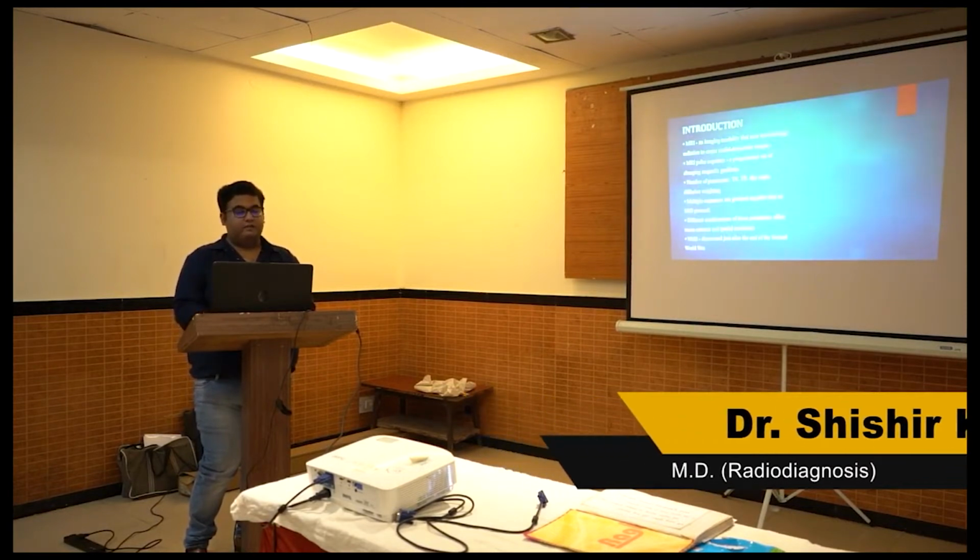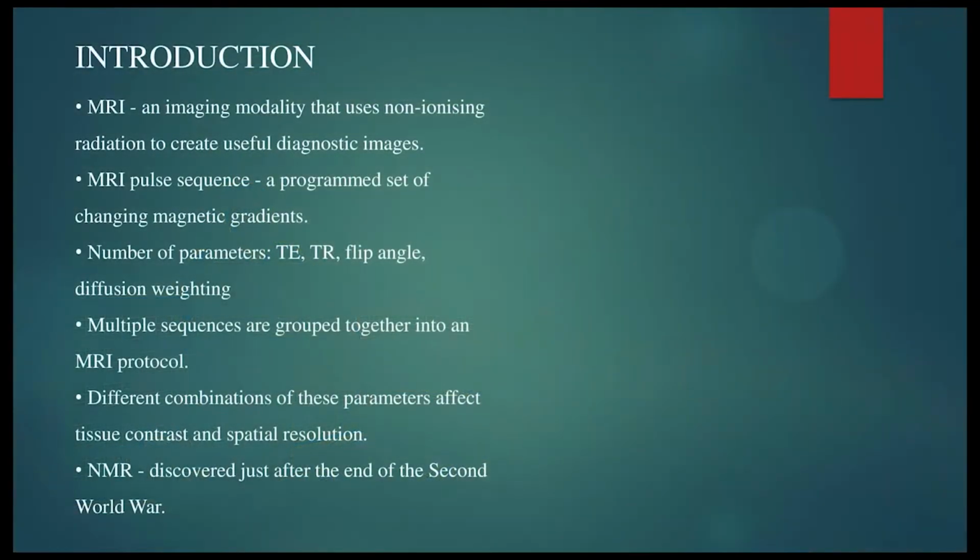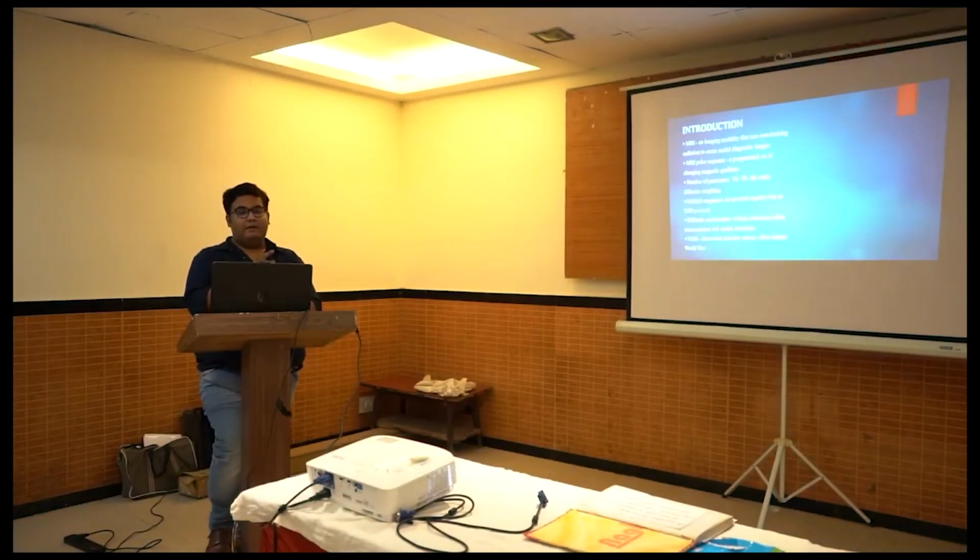So we should start. MRI is an imaging modality that uses non-ionizing radiation to create useful diagnostic images. So here we want to say that there is no ionizing radiation, so there will be no radiation hazard for the patient. Only magnetization is used for generating the images. There are MRI pulse sequences. There are a lot of protocols. We go through that and then we generate images of the patient on our machine.